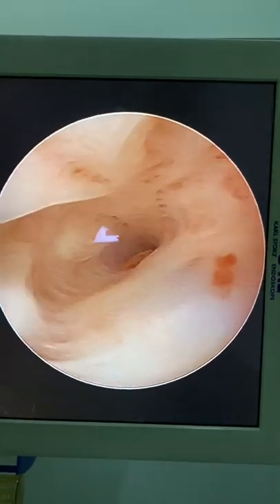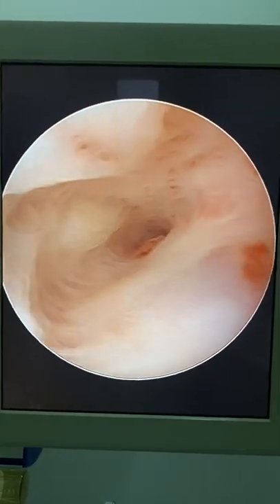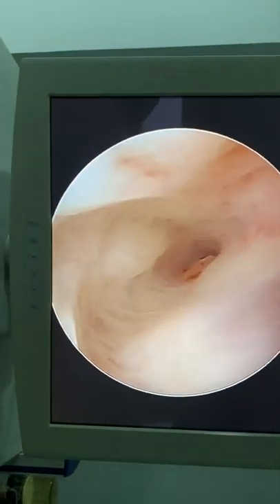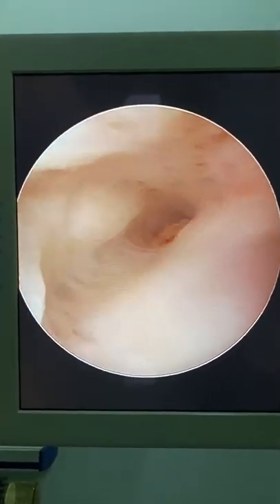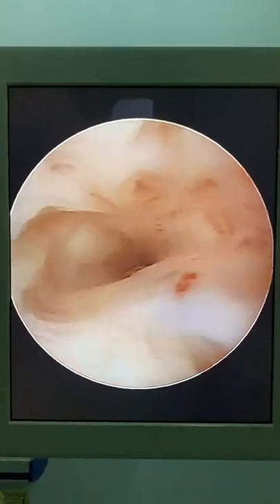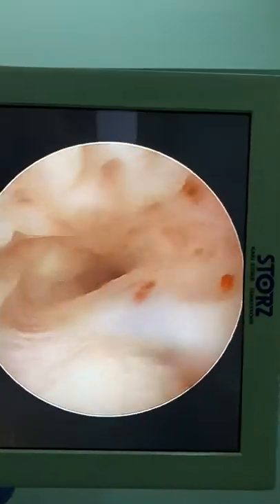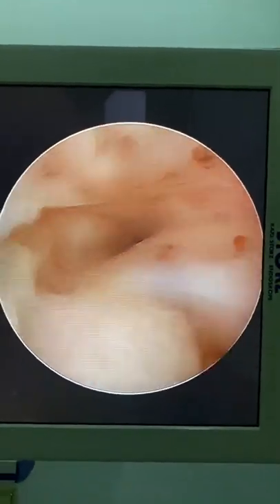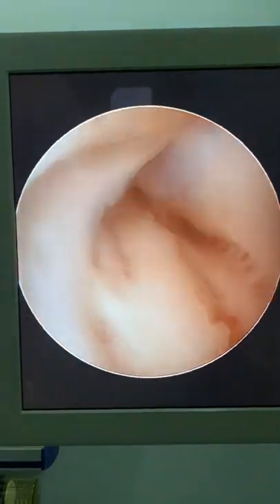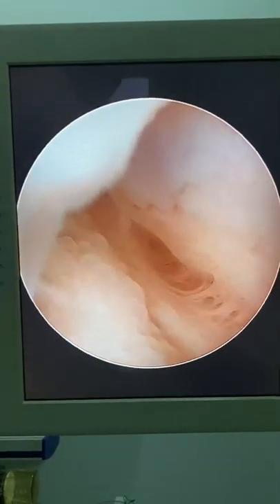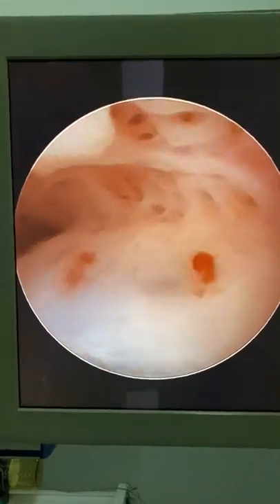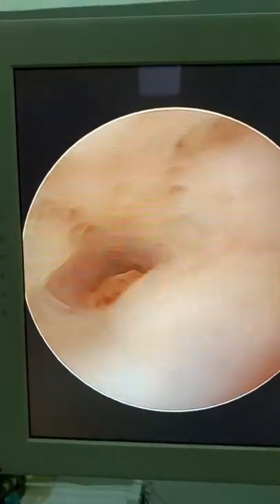I'm increasing the fluid pressure to get more distension and to allow me to glide slowly in. I'm pushing the scissors now through the operative channel. Yahya is saying it looks like a septum, but I think it looks like adhesions — I'm not sure. We have to try this.